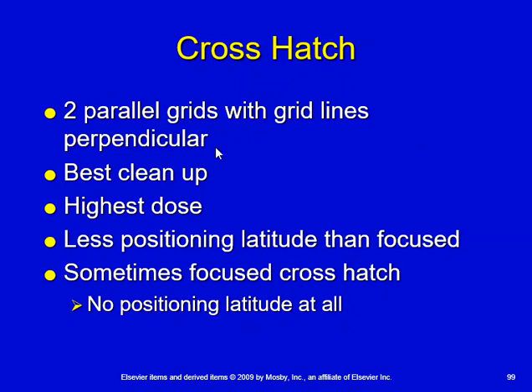Unfortunately, that's going to come with the highest dose. So with the best cleanup, you get the best contrast improvement, but the patient's going to pay for it in patient dose. And then you've got less positioning latitude. You can't angle the central ray in either direction with crosshatch.